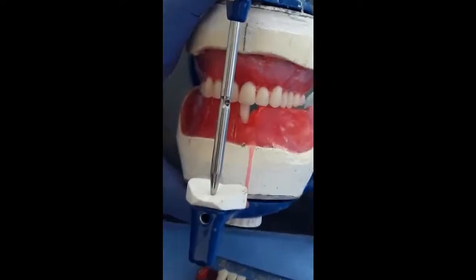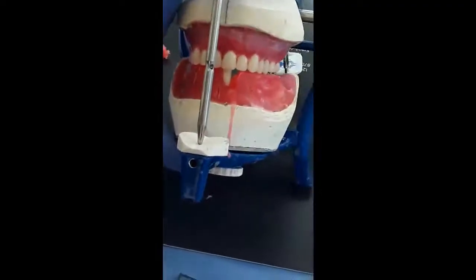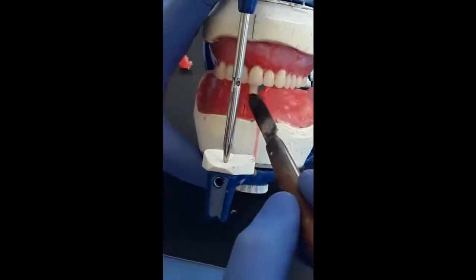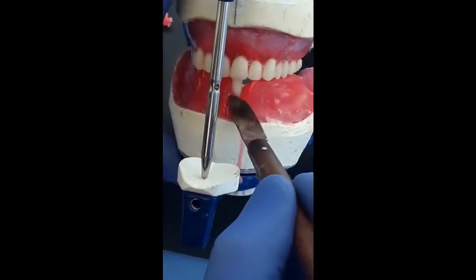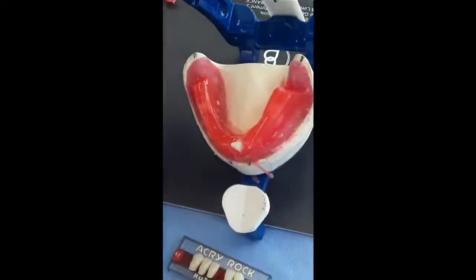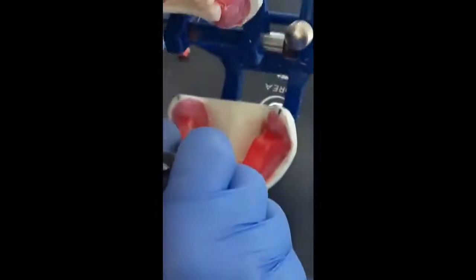Now we secure the tooth in its position. We use a hot instrument by melting the wax around it, and you can notice that the neck is slightly depressed. We also secure the tooth from inside.